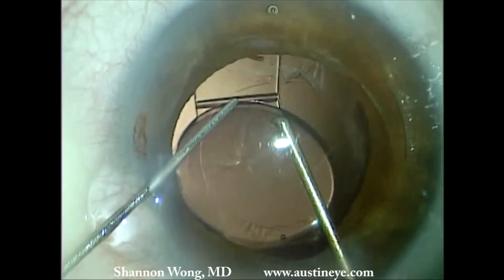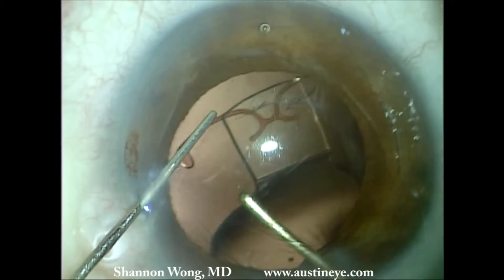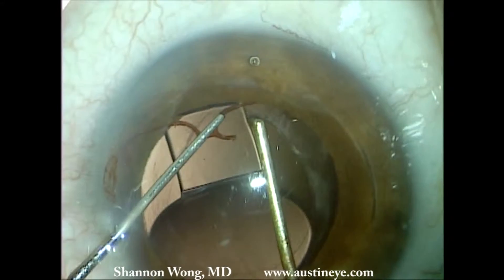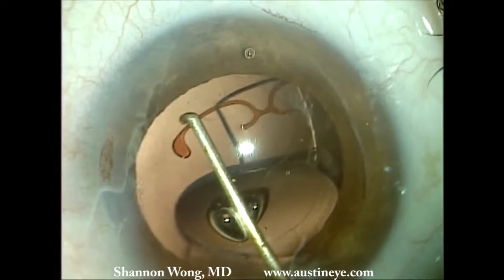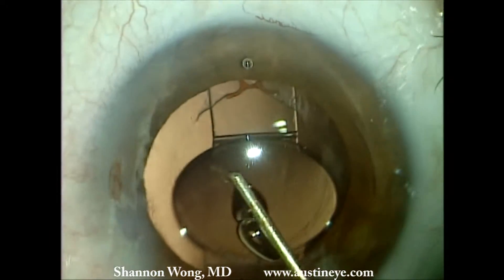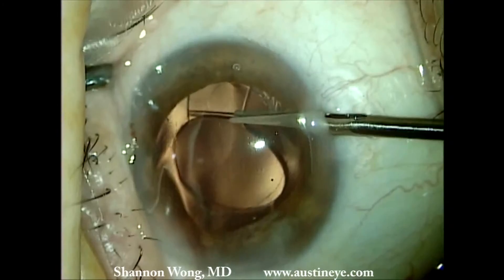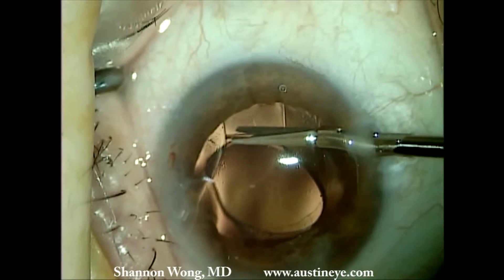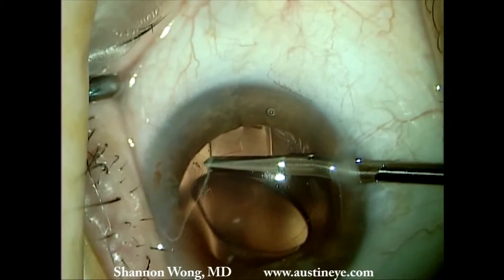We free up the haptic that is not fibrosed into the capsule and discover that we still cannot liberate this end of the lens implant. We then introduce MST micro scissors and decide to amputate this haptic, as we cannot remove it in a safe manner.